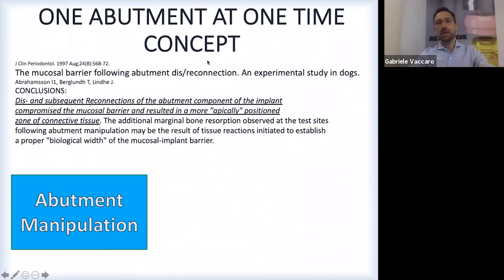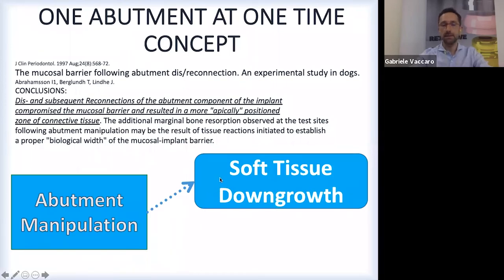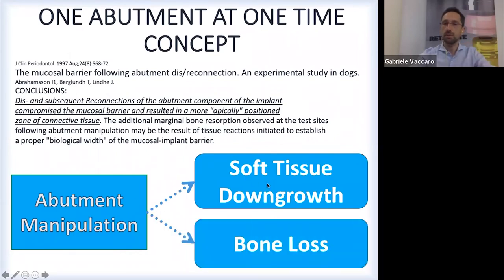And now I can introduce the one abutment at one time concept. This means that once we put an abutment, we have to put it here and maintain it here for the rest of the job, because they demonstrated that just reconnecting the abutment caused a loss of biological width. They measured a starting point for the downgrowth of soft tissues without plaque accumulation. So just mechanical screwing and unscrewing produced the downgrowth of soft tissues. And this is, as we said before, the first step for the bone loss around the implant.